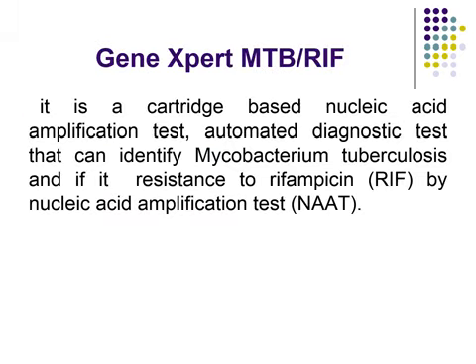Another test used now, and widely used in Iraq, is called GeneXpert MTB/RIF test. This test is a simultaneous rapid tuberculosis diagnosis.